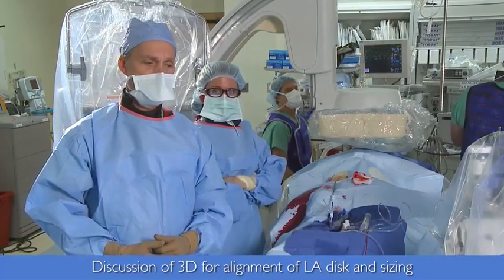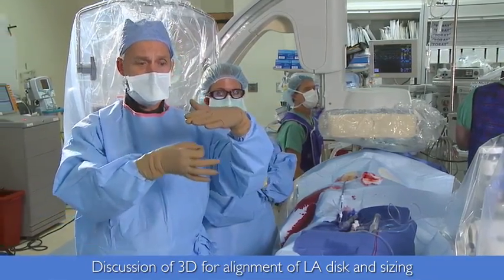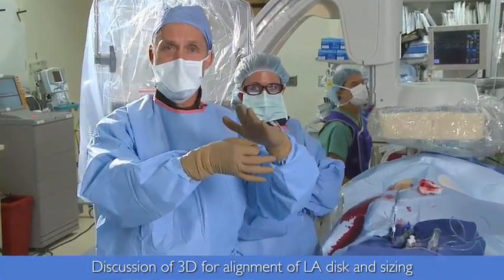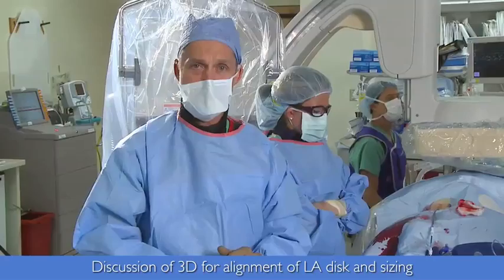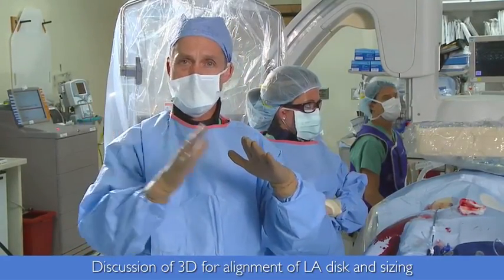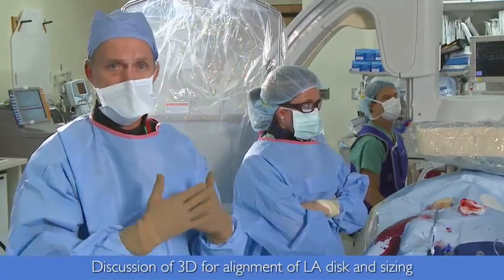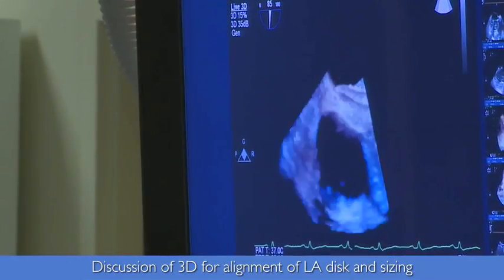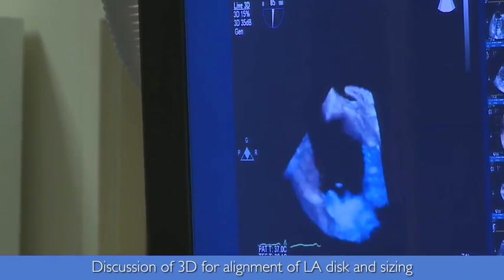these devices by first focusing in on the alignment of the left atrial disc to the secundum atrial septal defect. If we just had one 2D ultrasound image, it might look good in one image, but in another perspective, it may be way off, and then we try deploying it and we miss the rim capture. So this really makes the process of ASD closure much more straightforward.